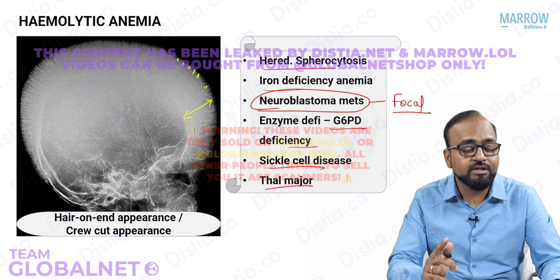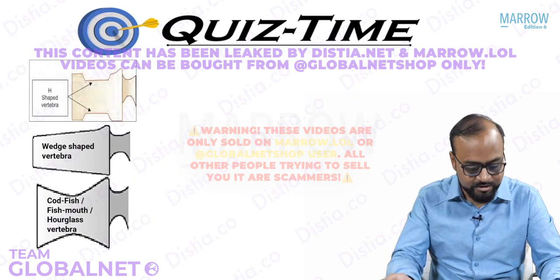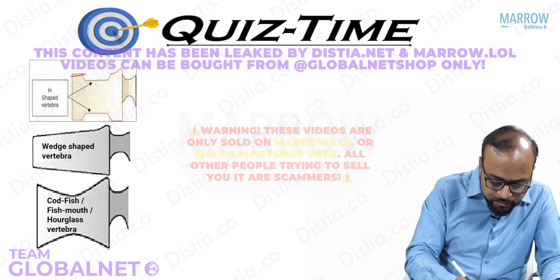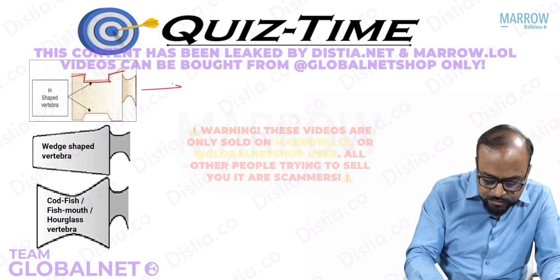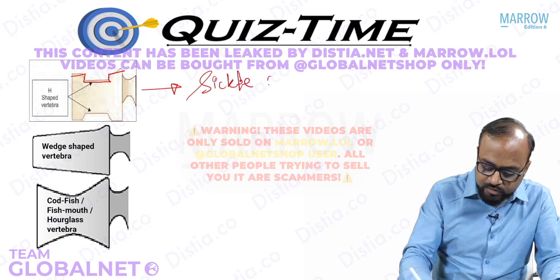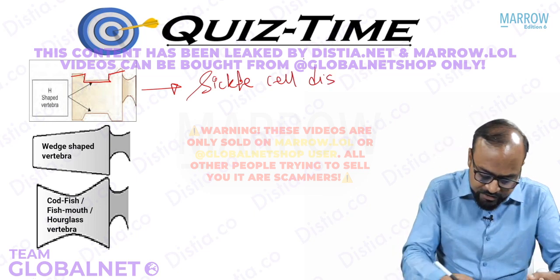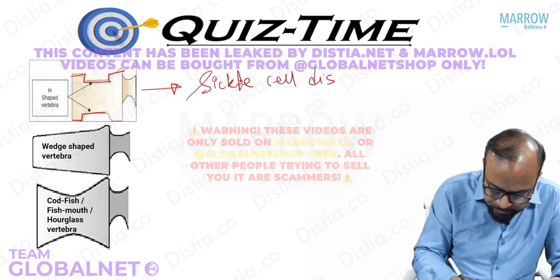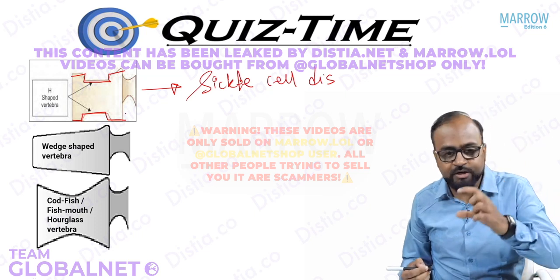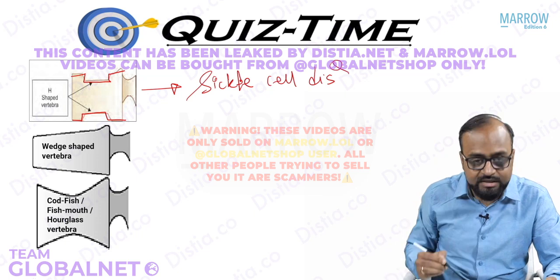Now you must know that there are various classical appearances of the vertebrae or the spine that have been described. So the typical appearance of the vertebra called H-shaped vertebra like this is a feature of, remember, sickle cell disease. Because of the infarction of the central part of the end plate, the central part of the end plate gets depressed. The peripheral part of the end plate is normal. This gives rise to the H-shaped vertebra of sickle cell disease.